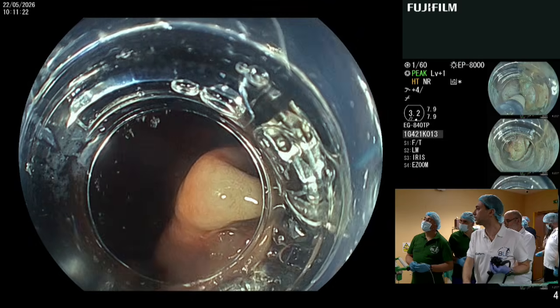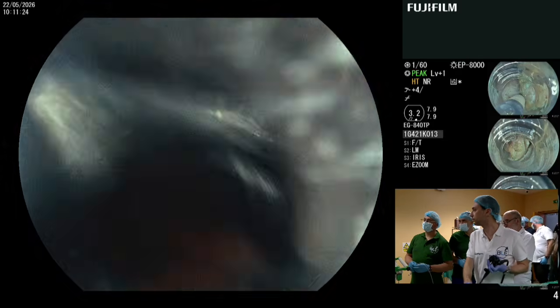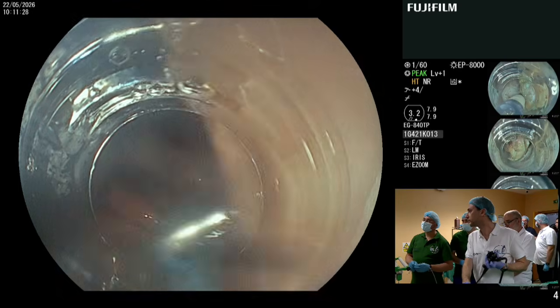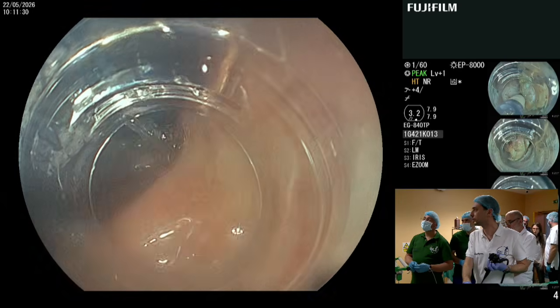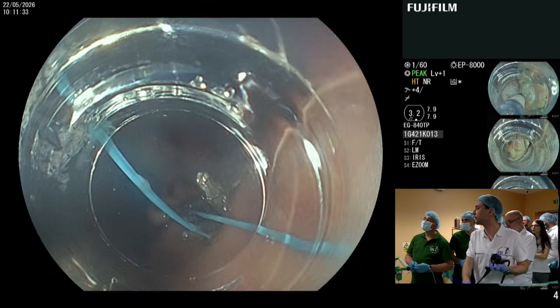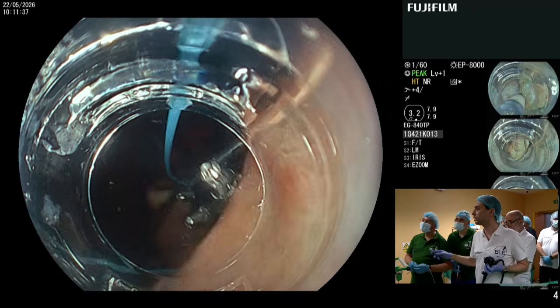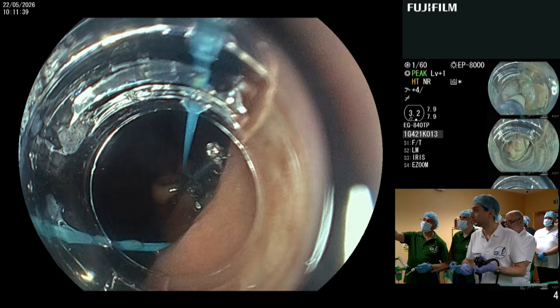Let me see. Wait. Where is the loop? You closed the loop. Okay, open it. Yes, yes, now it's good. All right. Now we have to grasp. Yes, I understand now. Give me the next clip, please.